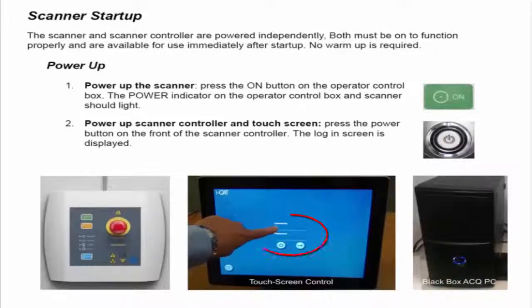After the touch panel has been turned on, you will be asked to provide a username and a password. After you have entered these, the touch panel will now be ready to receive scheduled exams. The username and password should have been given to you at installation. If not, you may contact iCAT Technical Support at 800-205-3570 and they will be provided to you.